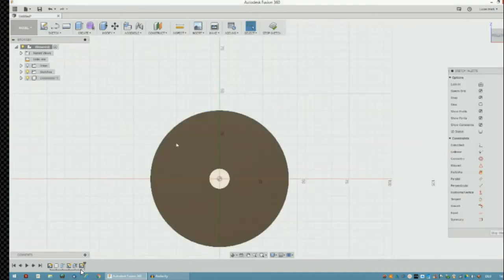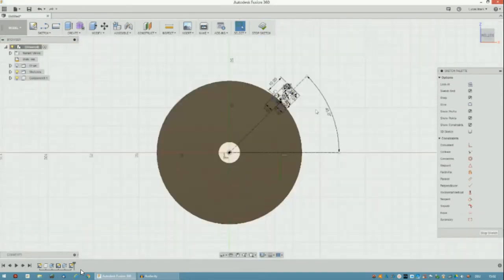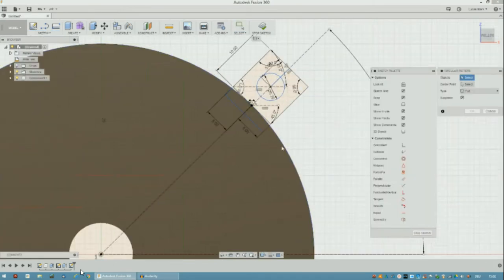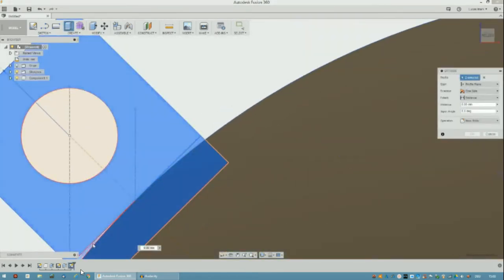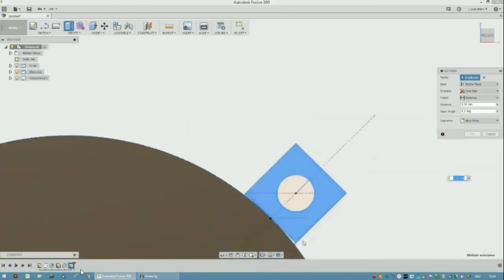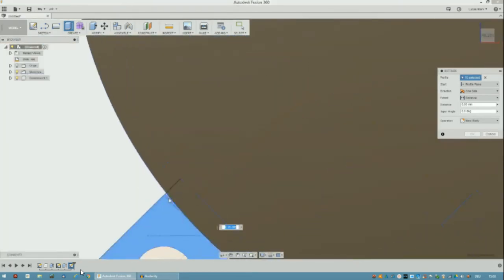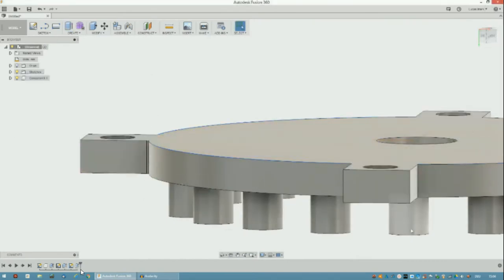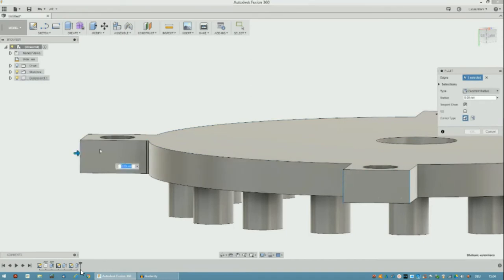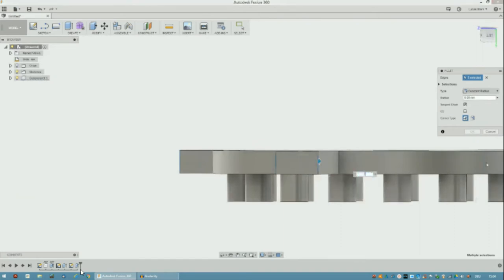Now I want to add some little lashes. Yeah, I draw them really quickly. And multiply them all around times 4. Now I extrude them and make some fillets to make it look nicer. That's also adding to the component. You don't need to choose the part which is already in the existing part. Now fillet this. I think there's a better way to do this, but yeah.